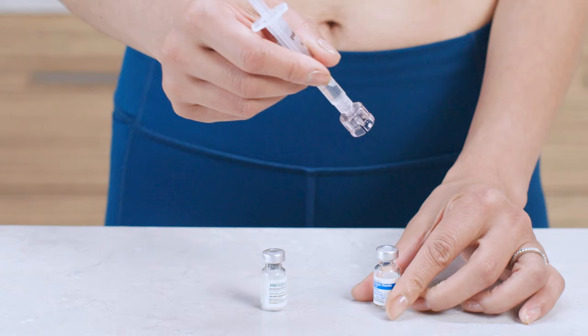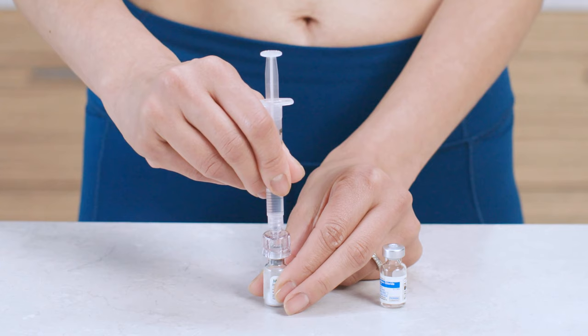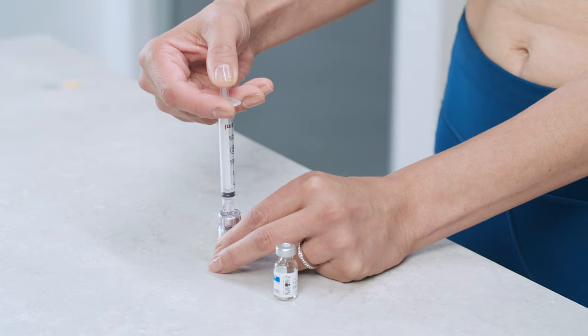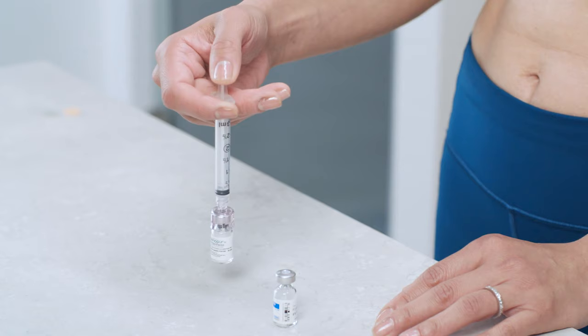Just be careful not to pull on the plunger during this step. Next, place the vial of Menopur powder on a flat surface. Take the syringe you just prepared and slowly insert the spiked end of the Q-Cap through the rubber stopper and into the vial until it snaps in place. Then slowly press the plunger to inject the diluent into the vial. Without removing the Q-Cap, gently swirl the vial to allow the powder to dissolve. Then push the plunger down to remove any extra air that's in the syringe. You'll want to use the solution right after mixing.